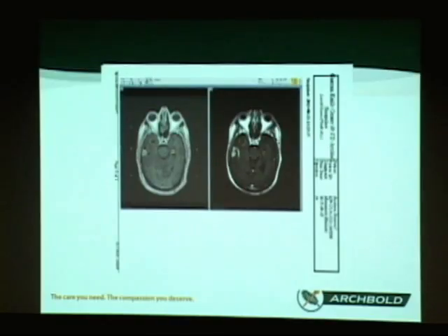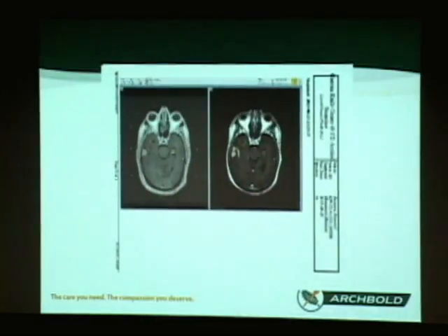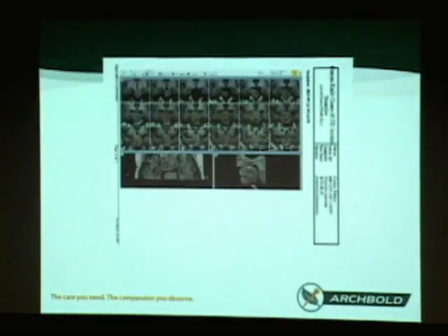So what I was attempting to do here is show you some before and afters. This is a before, and that's an after. So that shows complete disappearance of that particular tumor. So that's the before and that's the after. So that looks like recurrent tumor, but it's really not. That's just a reaction set up in the brain. So if you ever get a Gamma Knife and we repeat an MRI scan, there's sometimes some confusion about whether it's controlled or not, and we have to sometimes just follow with MRI scanning.